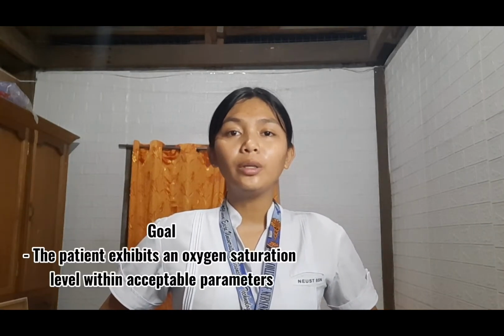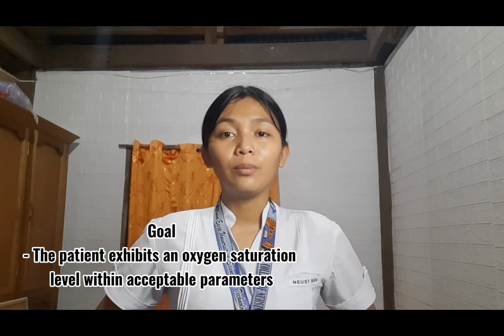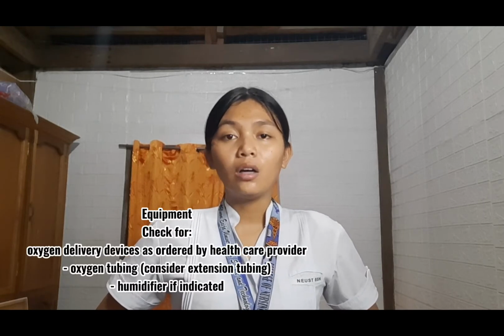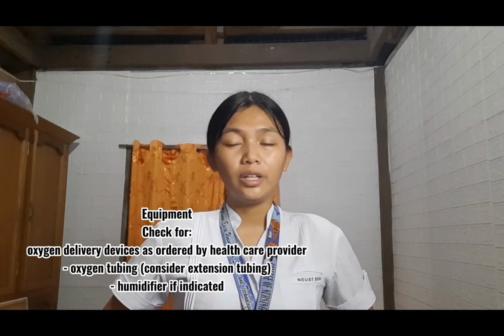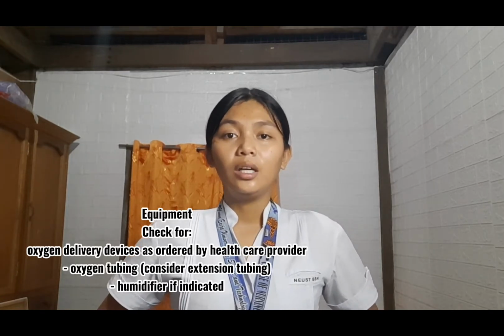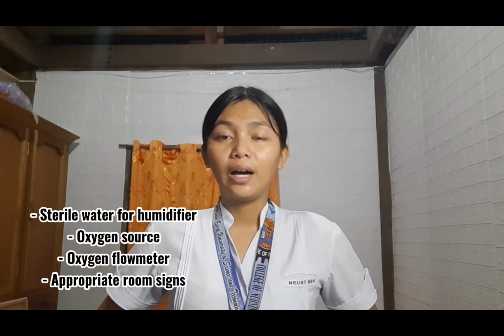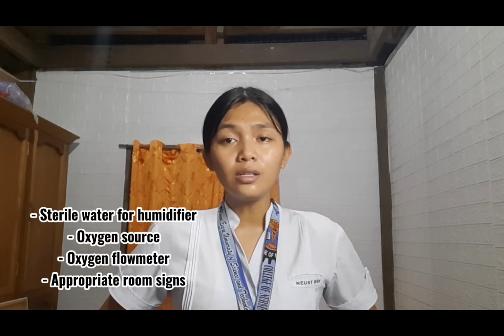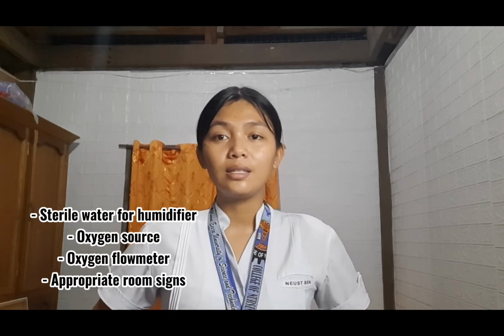Administering oxygen by nasal cannula. For the goal, the patient exhibits an oxygen saturation level within acceptable parameters. For the equipment, we need to check for oxygen delivery devices as ordered by the healthcare provider. Oxygen tubing, consider extension tubing. A humidifier if indicated. Sterile water for the humidifier. Oxygen source. Oxygen flow meter and appropriate room signs.